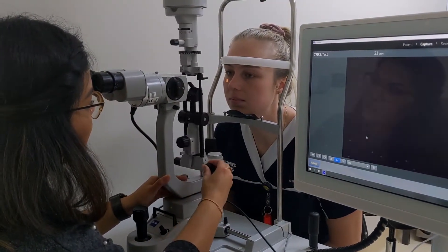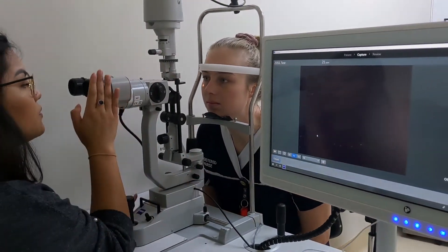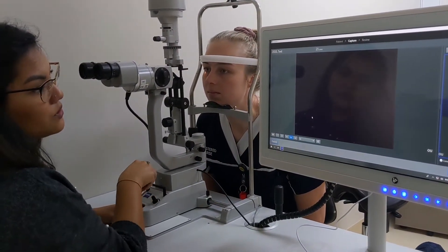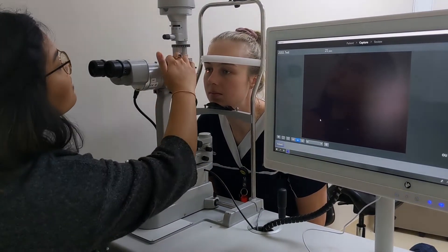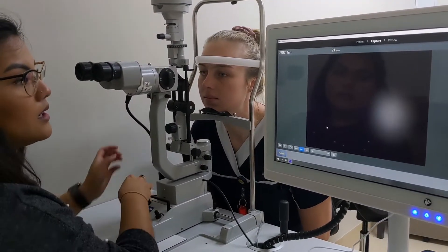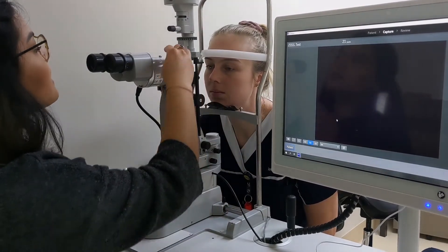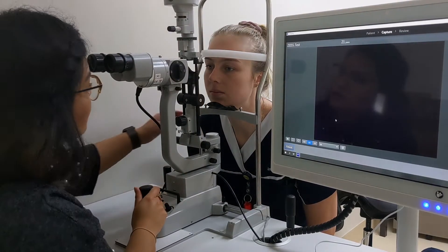You can view your picture in the binoculars or on the screen. Some people may find it more useful to use the screen because you get a live image there — our little camera is taking an image and showing it to us live. Here we can see Kelly's eye.